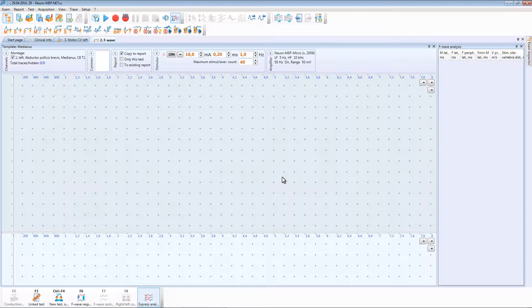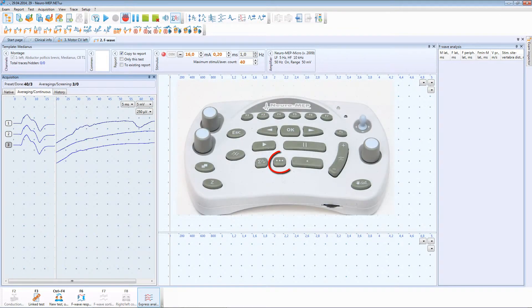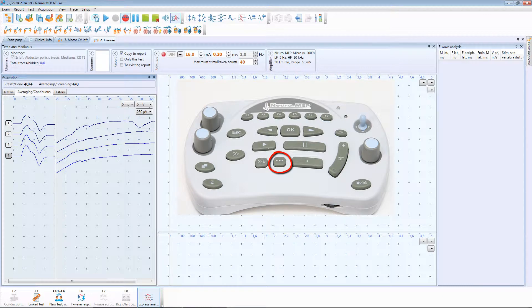In this test we run the repetitive stimulation by pressing the Acquisition with repetitive stimulation toolbar button. You can also use dedicated keyboard button for this purpose.